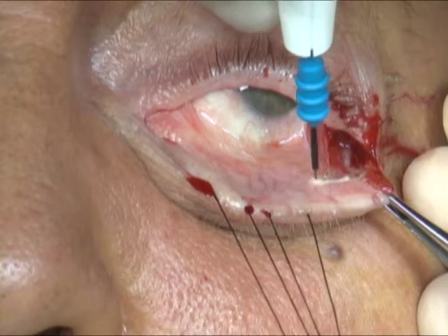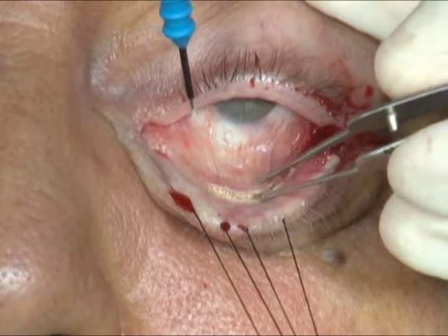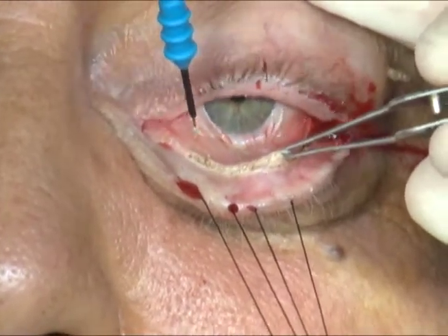The monopolar cautery is then used to make an incision through the conjunctiva and lower lid retractors, inferior to the inferior border of the tarsus, extending from the lateral canthus laterally to the punctum medially.